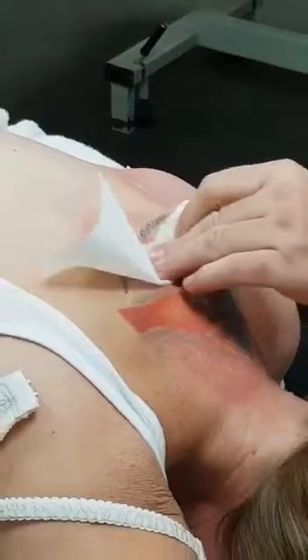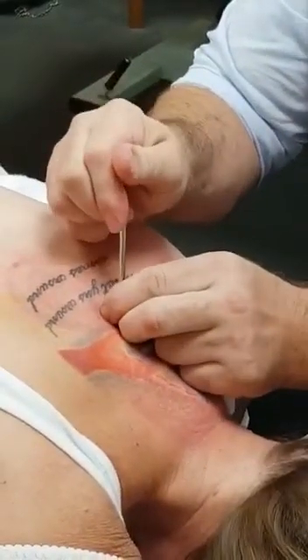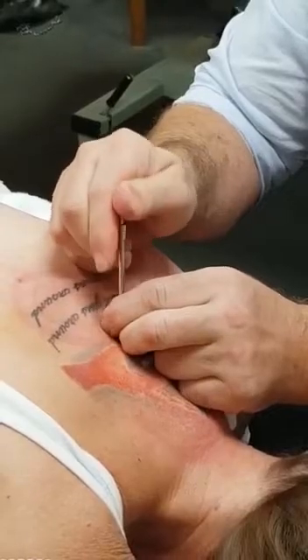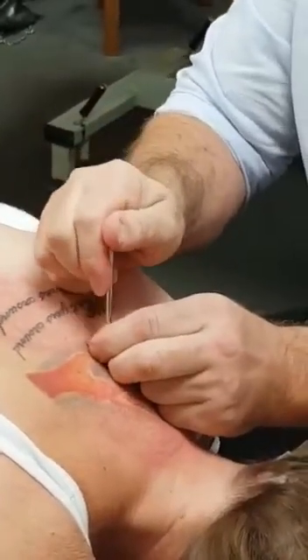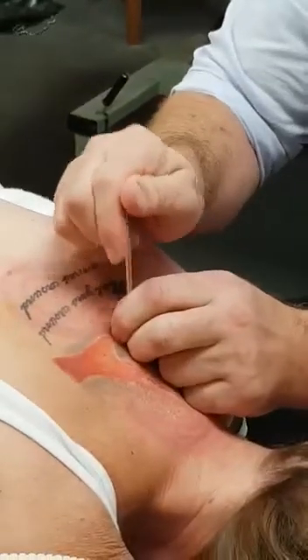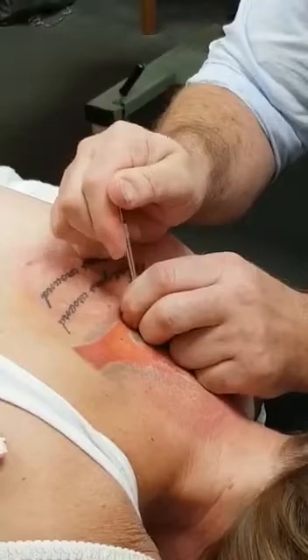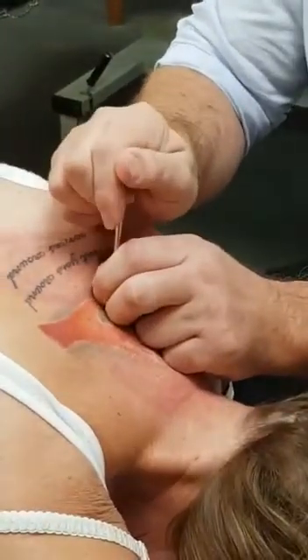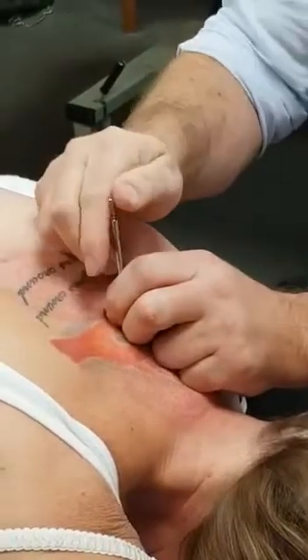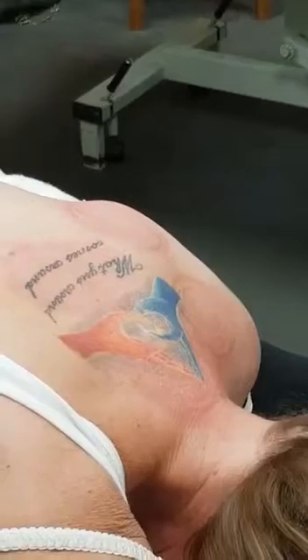You get your spot that's a little bit sore, but generally speaking it's not as sore as it looks. It actually doesn't look as bad as I thought it was going to look. There's a thickened, shortened bit there. I'm actually going to bend my needle if I'm not more careful, so just take it easy. There we go — started to get through, felt it through.